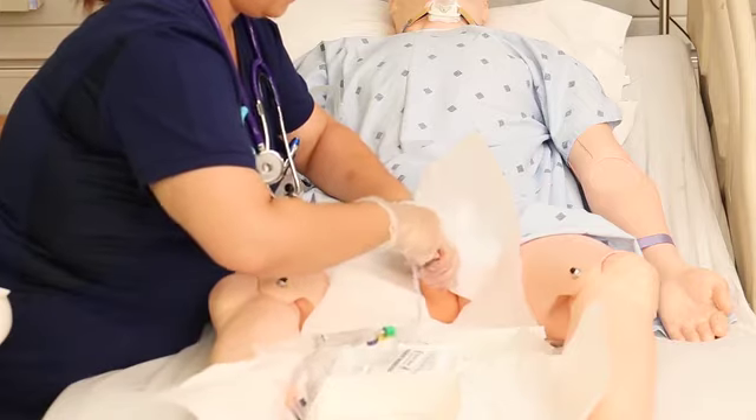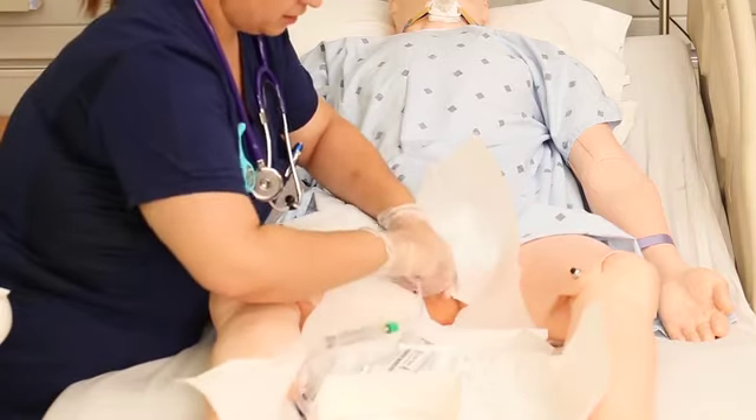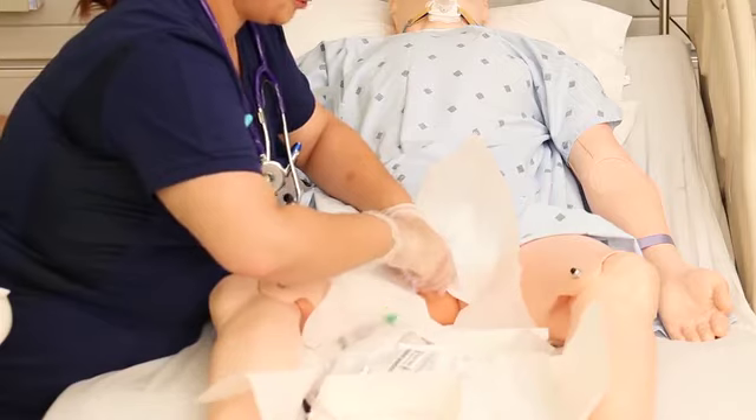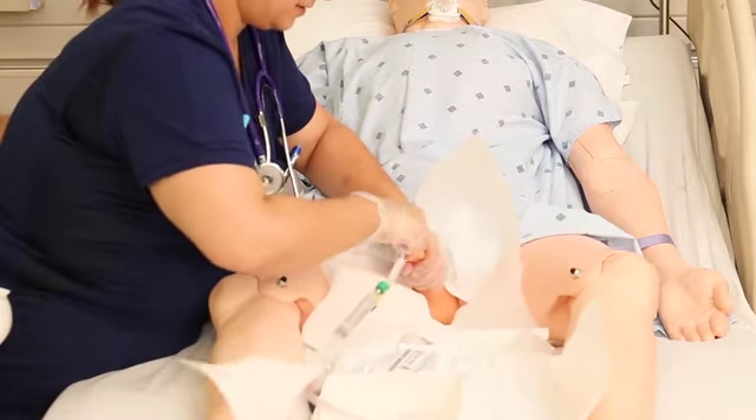If you have a patient with prostate issues and you're meeting resistance, sometimes lifting up on the penis helps. For severe prostate issues, you can get a coudé catheter — it's a little bit firmer at the tip, making it easier to navigate past the prostate.